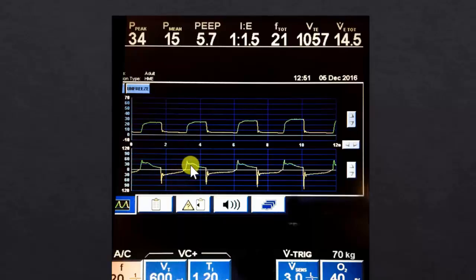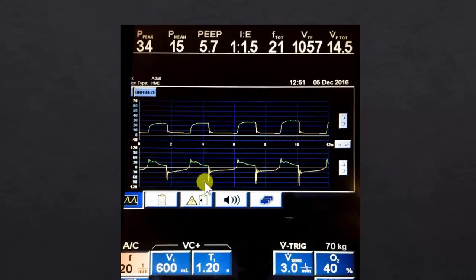The flow is maintained high in the mid flow and all the way to the end rather than ramping straight down. Also, we set a longer inspiratory time of 1.2 seconds before the flow was down to zero by about 1 second. In this PRVC mode, the patient also determines their flow. The cycle length is determined by the ventilator setting. So this patient's also synchronous.